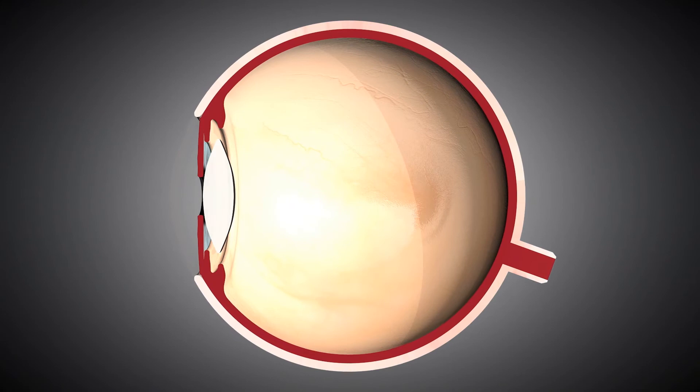IOLs today not only replace the cataractous lens, but also correct refractive errors of the eye.